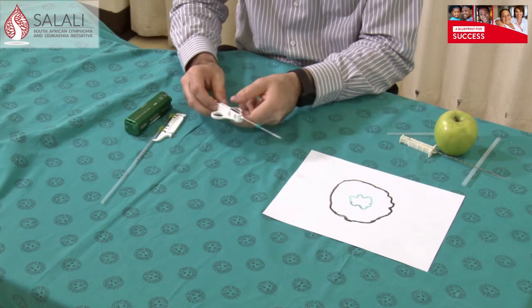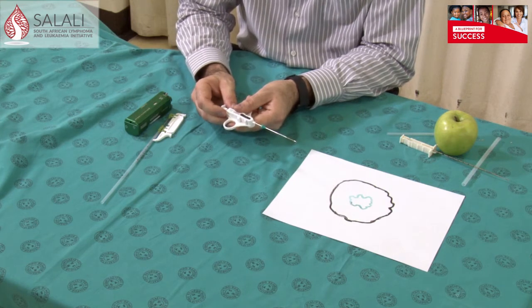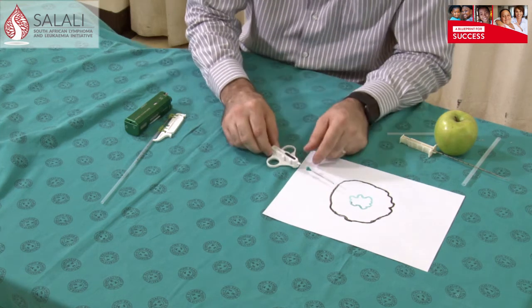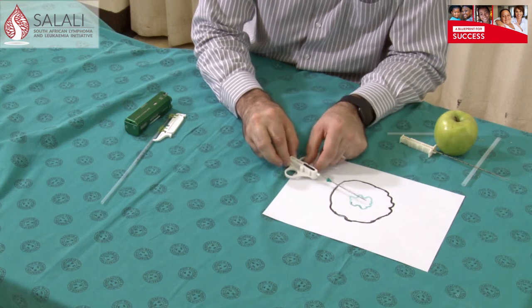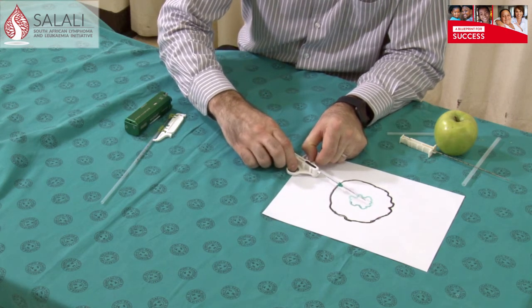You can then remove the needle. If you pull back and push forward again, that opens your biopsy channel so that you can remove your biopsy. The advantage of this is you can change your position if you want to. Once you are in and you advance and you are not happy, you can pull back and change your direction until you are happy, then activate your needle.